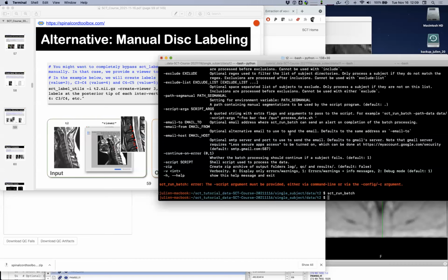It's non-affine, and the fact that it's non-affine makes it that there are unknown values above the top label and below the bottom label, right? So unless we do some extrapolation of the field, which we don't do because we don't want to generate wrong information, we simply chop off what's on top and what's at the bottom.